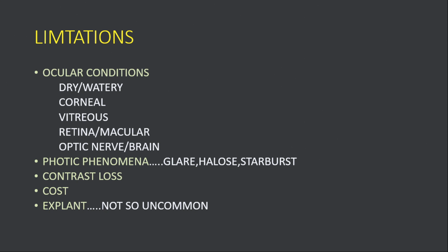But they have their limitations like ocular conditions, whether it's dry eye, corneal, vitreous, retinal, macular, optic nerve, any problem anywhere, the multifocal lenses are not suited. Then they have added photic phenomena, halos, glare, starburst. Then there is contrast loss and there is a cost involved. And explant of the multifocal lens is not so uncommon. So when we select the IOL, we have to see the finances, profession, ocular conditions and limitations the patient has.